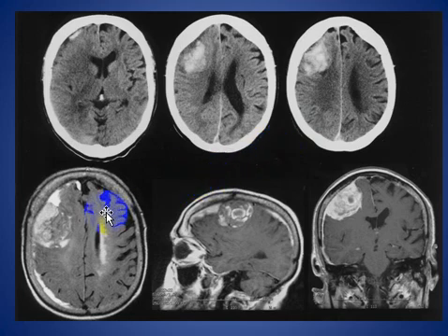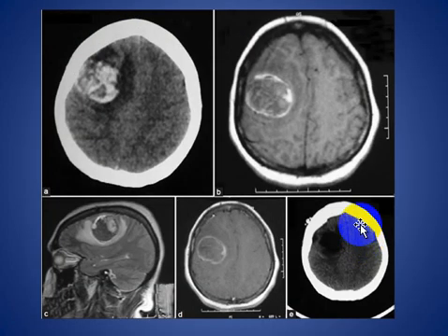Here, another patient with meningioma with the bleeding in the subdural space and in the right frontal operculum region, and with mass effect. Another patient with a neuroectodermal tumor presented with the bleeding on non-contrast CT scan. And this is the tumor after resolving of the hematoma.